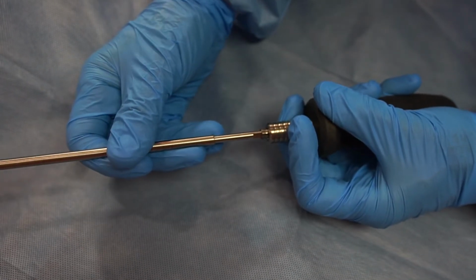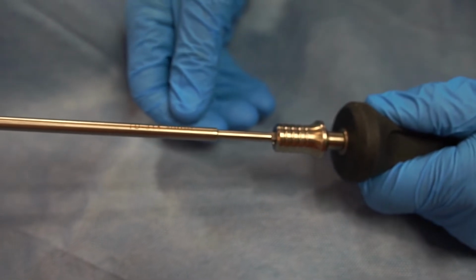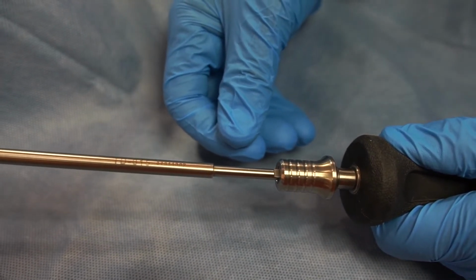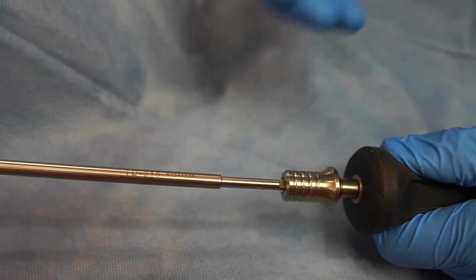Load the torque driver into the torque handle as shown. Ensure that the driver shaft is engaged with the handle. This can be verified by pulling on the shaft. Do not use the gray removal handle for locking the set screw.